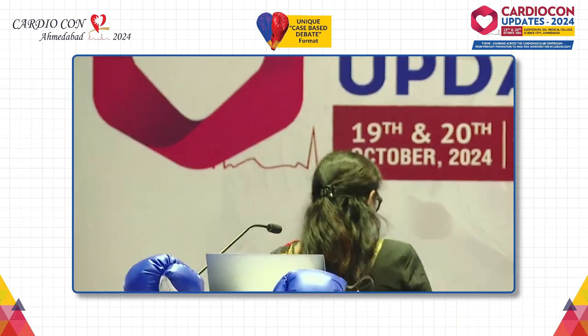So in left main intervention, for any ostial lesion, ostial stenting is not preferable because there are high chances of geographical miss and/or protrusion of the stent in the left main. So we are preferring crossover stenting. So I would like to ask Hasid sir, is there any role of final kissing in crossover stenting, or a role of a drug-coated balloon in final kissing?